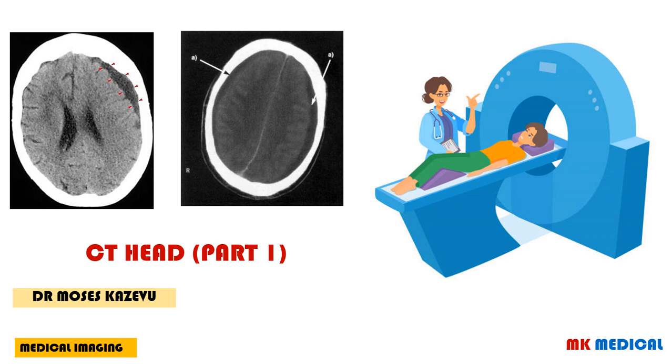Today we're going to be looking at imaging, medical imaging. So we're going to look at CT scans. I already started with a prelude, an introduction to CT week. So we shall continue now and start looking specifically at head pathologies, and we shall start looking at CT head. This is actually part 1. It shall be divided into separate important parts.